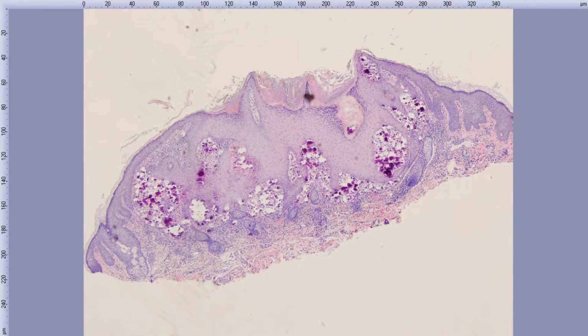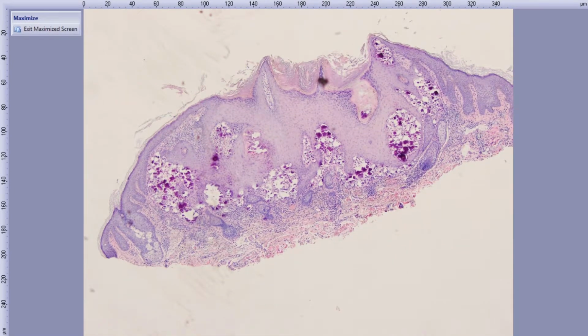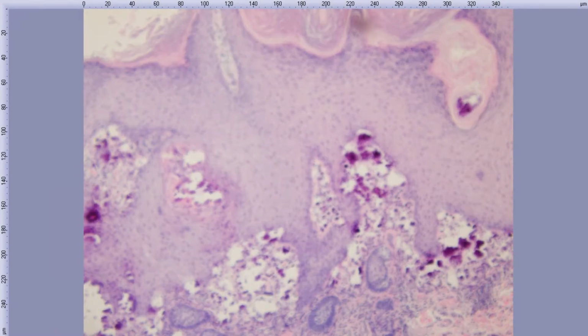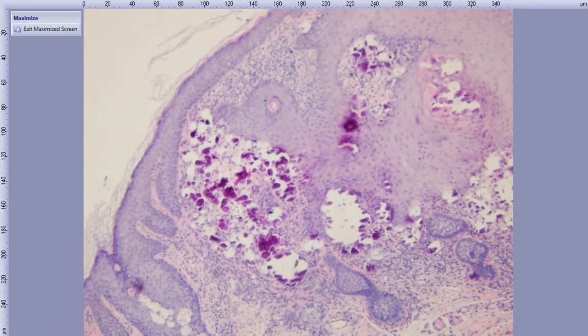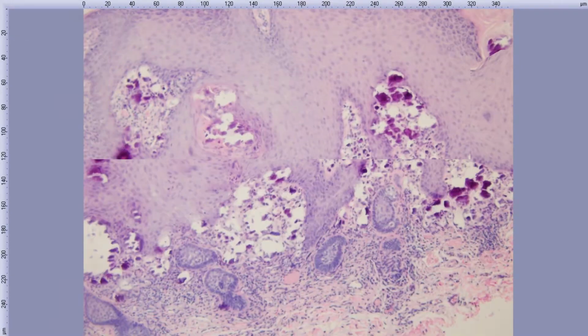Okay, so we're on number 7 of the unknowns. So we'll just go to this one here. Anybody have any thoughts on this here? What's this material? Calcium. Yep, somebody typed calcium, and that's what all that purple stuff is. It's just all deposits of calcium.